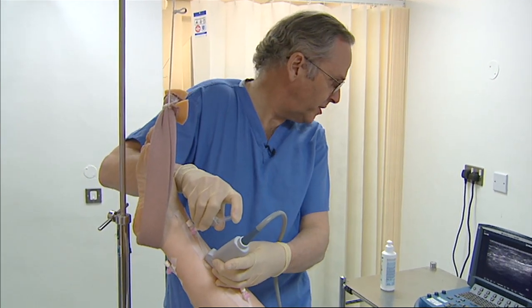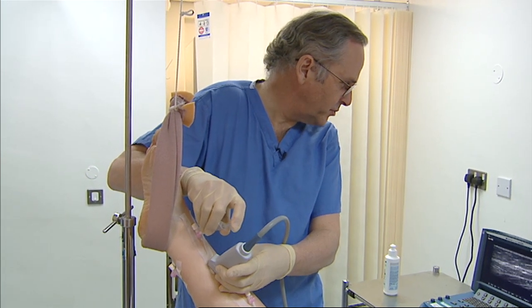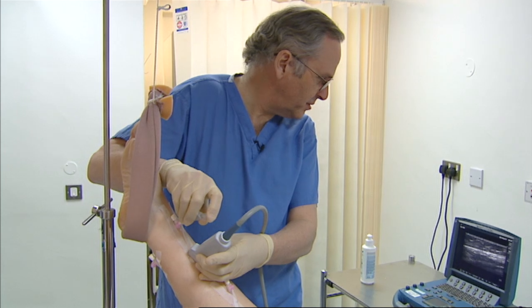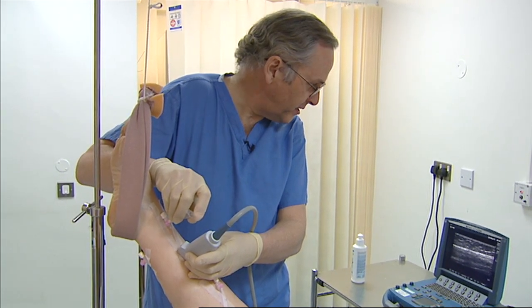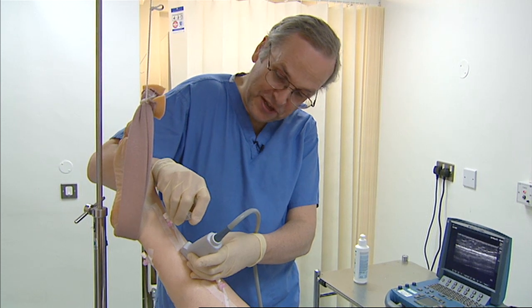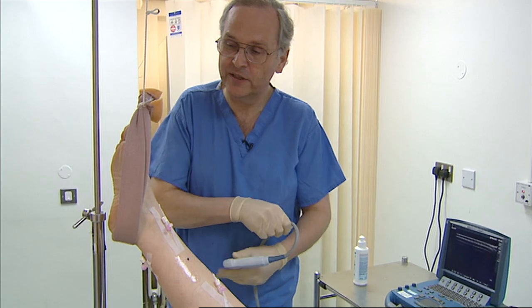We use the ultrasound to locate the saphenous trunks, which are usually not visible from the surface. We can also identify the relationship between the varices and the trunk from which they arise, so that we can place an injection in the right place. Ultrasound is invaluable in assessing the limb and subsequently putting the needle in the right place.